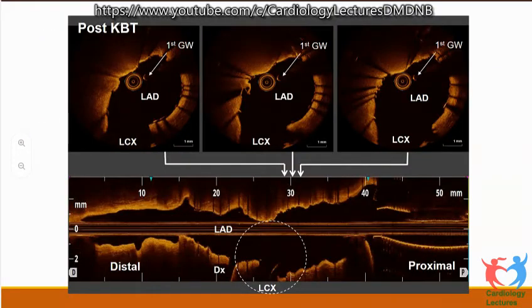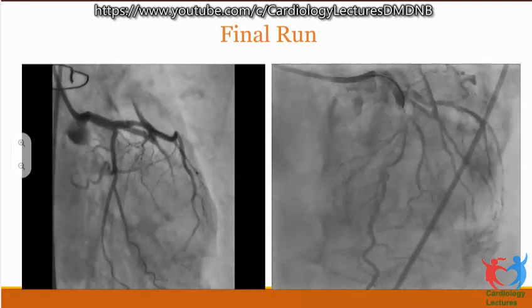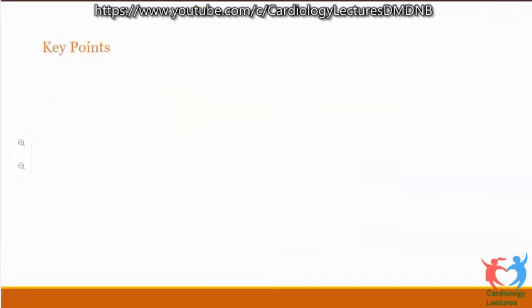The expansion indicator shows that the stent is well expanded, and when we took individual images, this is the guide wire which is going, circumflex guide wire into the main branch. So the stent is absolutely expanded with a very optimal result, and this final run showed a well completed OCT. So no medial dissection, well apposed, and the stents are expanded.